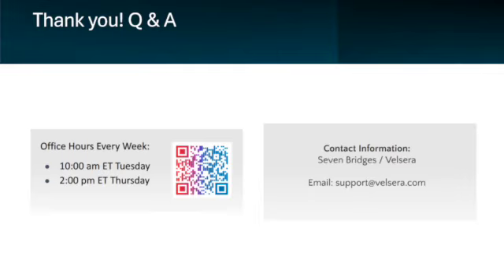That's fantastic, Dave. While we wait to see if we have any questions, I just wanted to say a few words. As we wrap up, we hope you've seen just how powerful 3D Slicer can be. It's such a good resource for imaging data. You can load, visualize, and analyze everything, as you said, Dave, from MRI to microscopy in 2D, 3D, even 4D. Now with those capabilities directly in the browser, you can combine them with a lot of different resources, like connecting them directly to your CGC project, as well as accessing data from various resources.